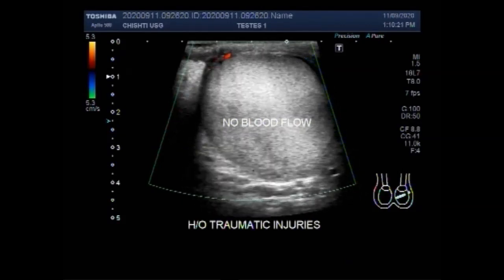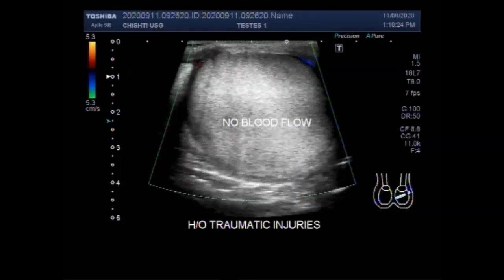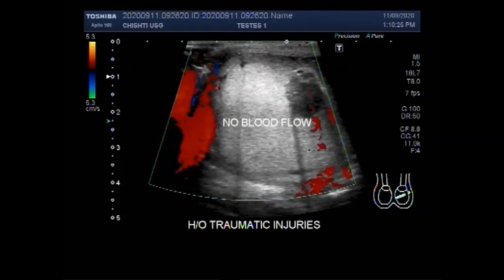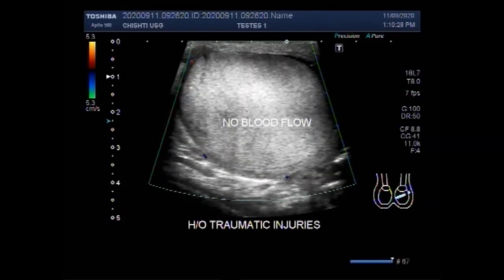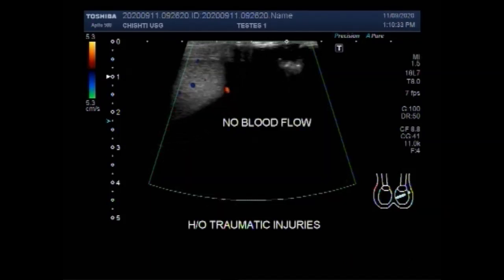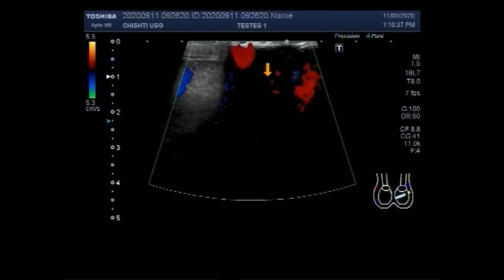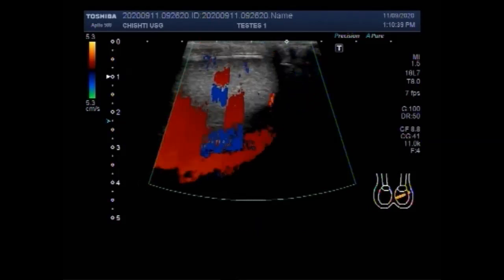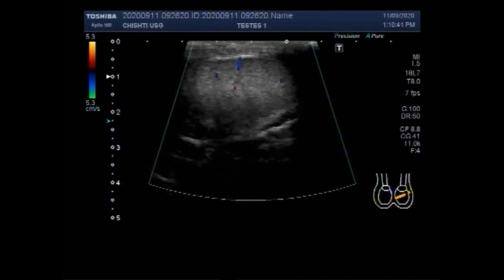High frequency ultrasonography with a linear array transducer is the modality of choice for the initial evaluation of patients with acute scrotal pain after trauma. Testicular trauma is the third most common cause of acute scrotal pain.